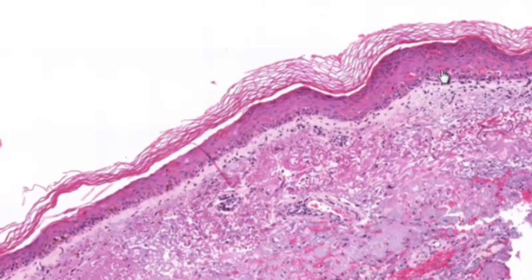Sometimes PLEVA can show a significant number of dyskeratotic keratinocytes. However, in PLEVA, we typically see more of a serum crust present within the stratum corneum. The inflammatory infiltrate tends to be both superficial and deep, and wedge-shaped as well.